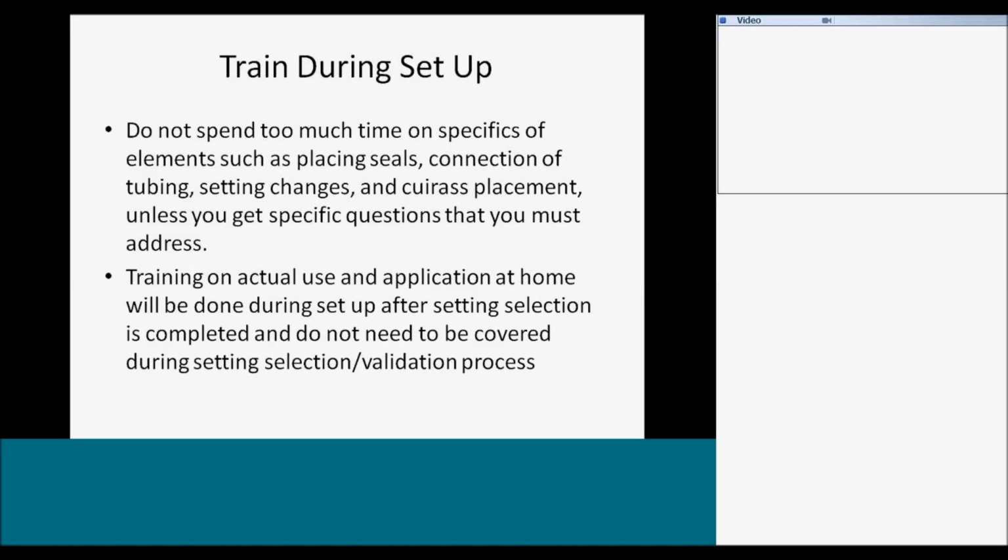And I'm doing this out of order, but I always like to start with setup, which is really one of the most basic parts of it. So training on actual use and application at home is done during the setup after setting selection is completed, and you don't need to cover that necessarily during the selection and validation of the setting.